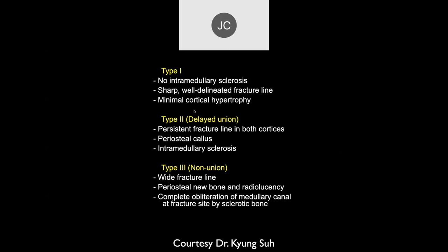To differentiate the types of stress fracture and acute Jones fracture: Type 1 shows a sharp delineated fracture line, edema on both sides on MRI, no sclerotic bone at the margins, and no cortical hypertrophy — this is before a healing response begins. In delayed union — Type 2 — you start seeing a fracture line with a healing response involving the cortices, periosteal callus formation on both sides, and intramedullary sclerosis. Periosteum is very important in healing these fractures.